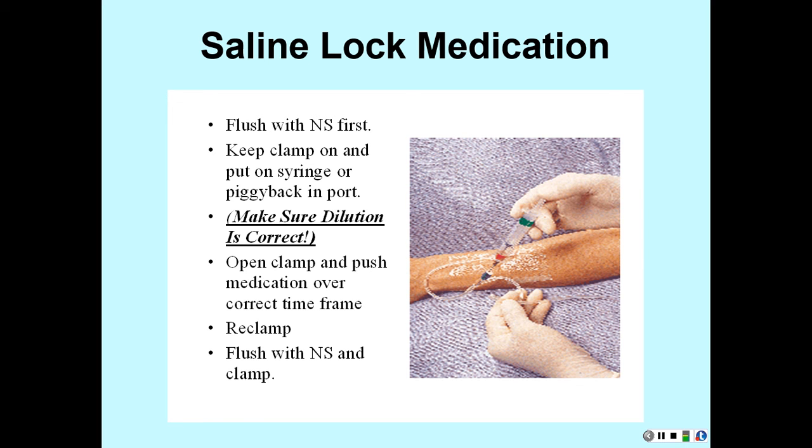Because if you flushed it over a minute, you still got drug in the catheter and in the extension tubing. And if you go in there and just go whoosh with your flush, you're bolusing your patient with the last part of the medication. Your patient can respond to that. Okay? And then you reclamp it, and you're done with it.